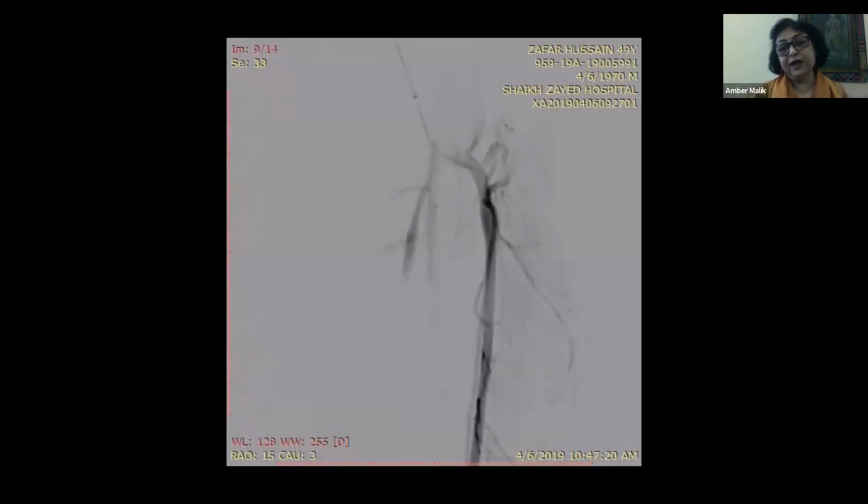But if you can see that from the top, we are not in the right place, but we use fluoroguidance, so we are already accessed from antegrade. You can actually inject and at the same time try the PV. So this is fluoroguided, right? But the vessel is there, but the wire still does not go. This is our early learning experience, but it is difficult, right? So you think that you've got the wire in, but it's not there. So you must guide accordingly.